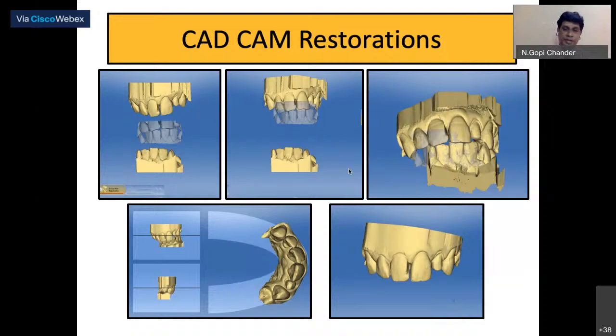The principle here is more in terms of a combination of various aspects of augmented reality. Basically, it's going to capture an image at various platforms or various interfaces. You take these captured images and stitch them into one model that is going to be the life-size model, what you make in terms of the cast, or die stone cast, or dental stone cast.